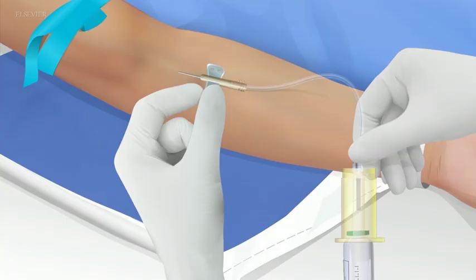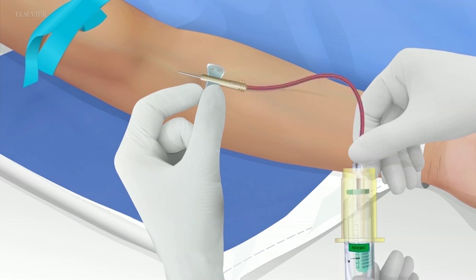Transfer the specimen to the culture bottles. Without dislodging the needle from the vein, push the attached collection barrel onto the prepared aerobic culture bottle by inserting the sheathed needle through the rubber stopper so the vacuum pulls the blood into the bottle. Collect a minimum of 10 milliliters of blood into the aerobic bottle.